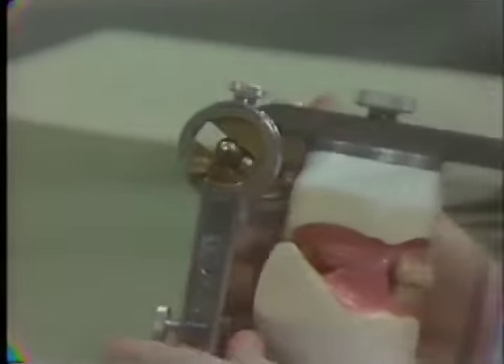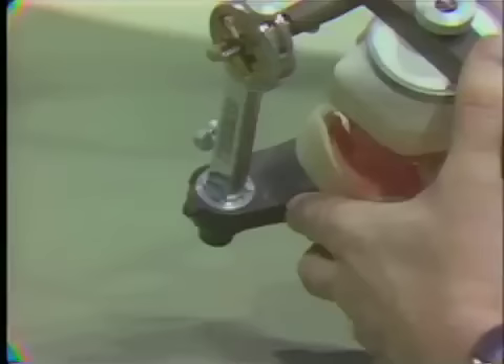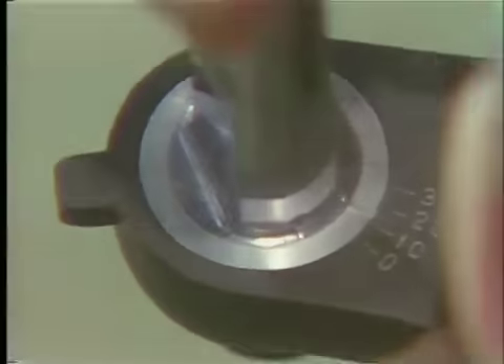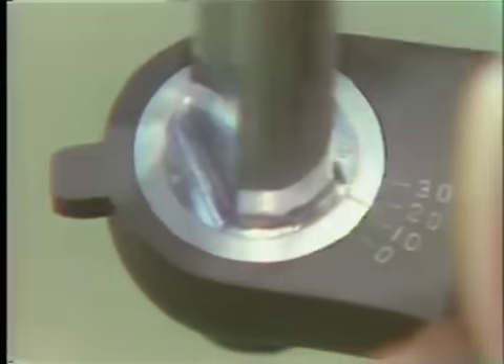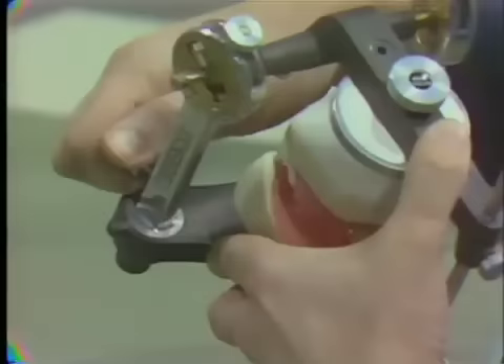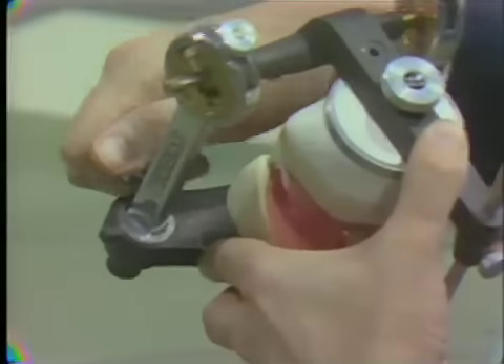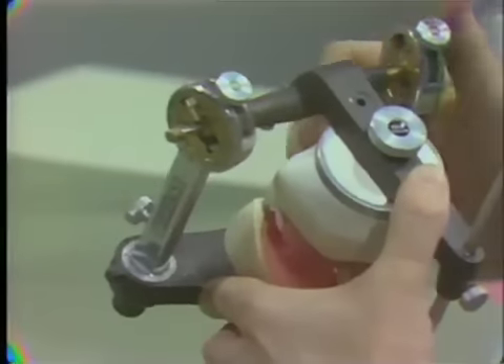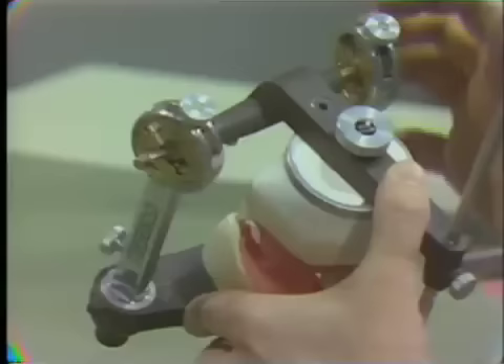The second thing is we should have a 15 degree Bennett angle. As we look straight down on the articulator, you all know how to adjust the Bennett angle, so I'm setting that at 15 degrees — red on the lower part of the instrument — and tightening down the nut so it doesn't turn when we start to use the instrument. That takes care of two of the determinants in the condylar area and the other side has already been set.